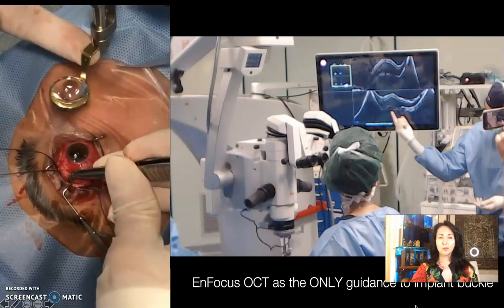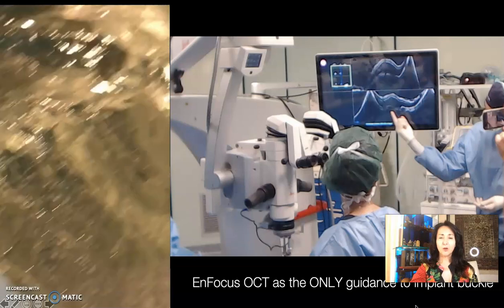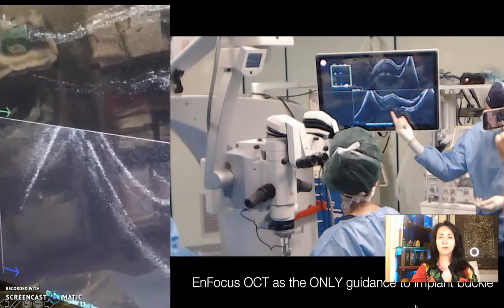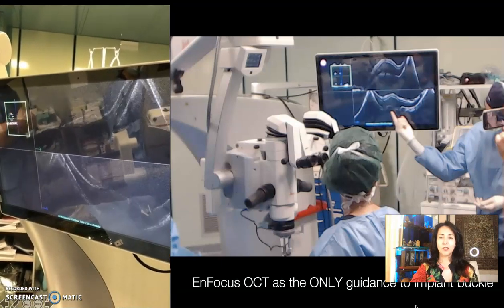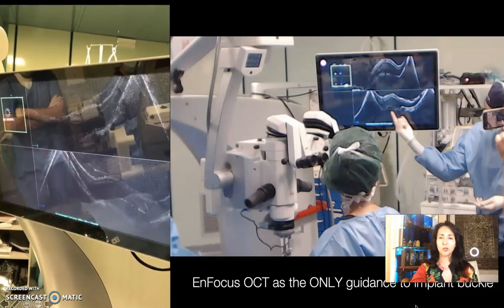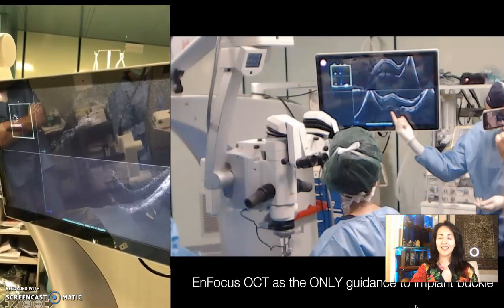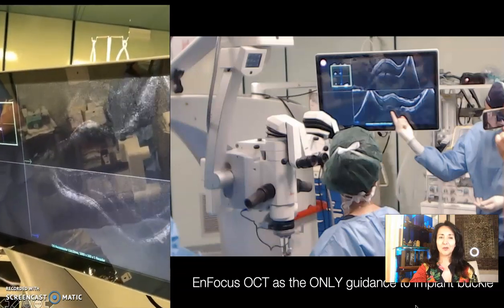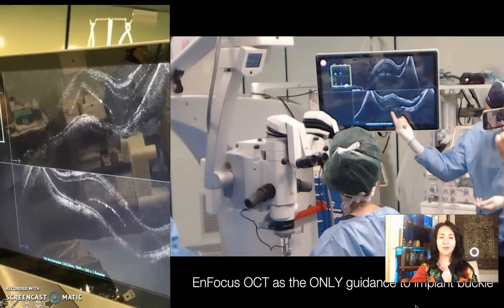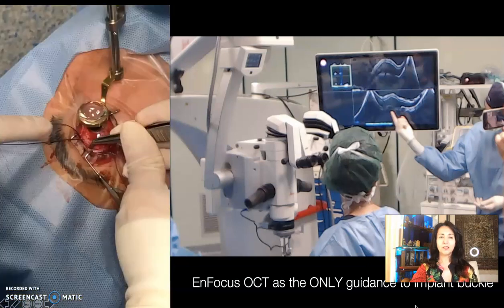This is an extreme case. I am implanting a macular buckle only with the guidance of intraoperative OCT without endoillumination at all. This is only buckle with no vitrectomy. So you see my coworker pointing and the location of the buckle, which is exactly under the fovea, and you see the images live through the intraoperative OCT.